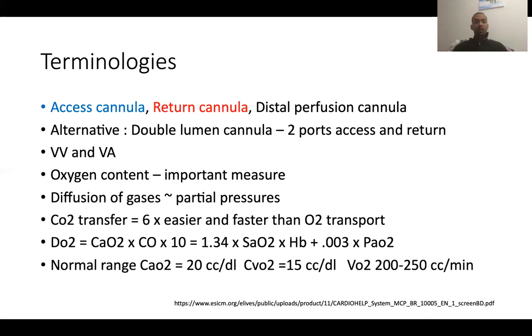Okay, and that's an important issue, as you will see in adjusting things on the sweep gas and also trying to liberate the patient from the ECMO. You'll see that the oxygenation happens much slower compared to the carbon dioxide recovery.